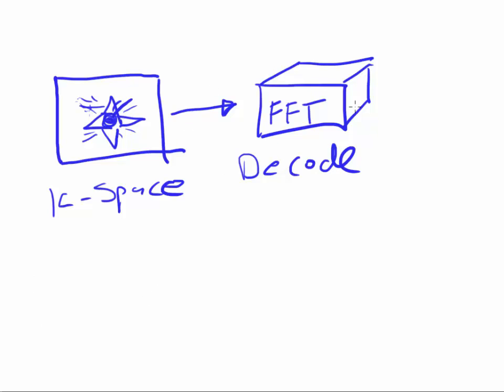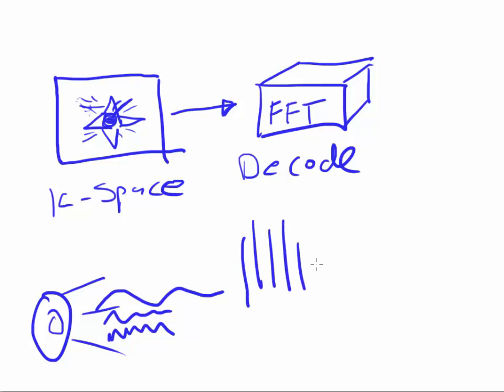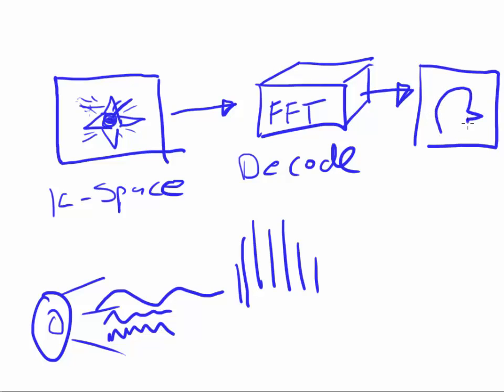You can liken what's happening in a Fourier transform to what's happening with your home stereo speaker. In a home stereo speaker, you have frequencies of various wavelengths. You've got your woofers, tweeters, and mid-range: high, low, and medium frequencies. Now, if we convert that to a different form of plot, we can look at that on a frequency spectrum. So this same type of analysis, the same change, is called the Fourier transform. It's what's going on inside, except far more complex than in your stereo. What happens then is the image comes out the other end of the Fourier transform. This is where the radiologist will look inside your body and see what's going on.